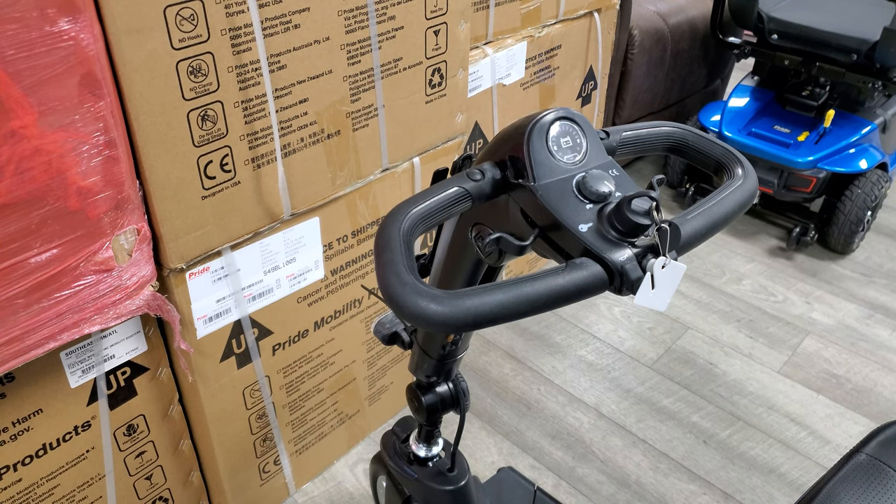Hi everyone, I'm Drew with Mobility Direct, and today I'm going to be showing you how to replace the horn on your mobility scooter — or you can call it a buzzer.